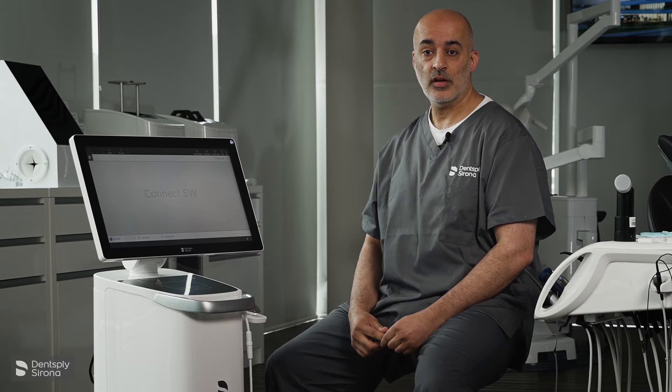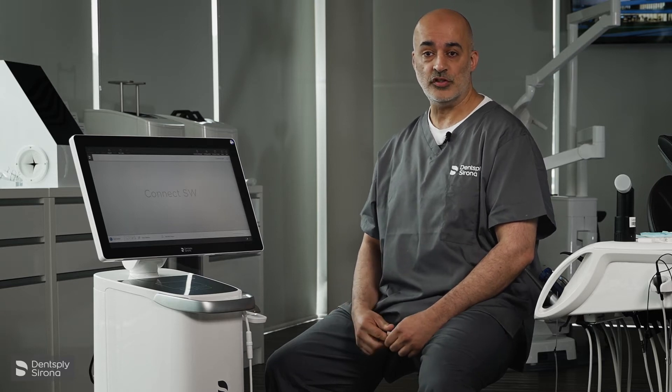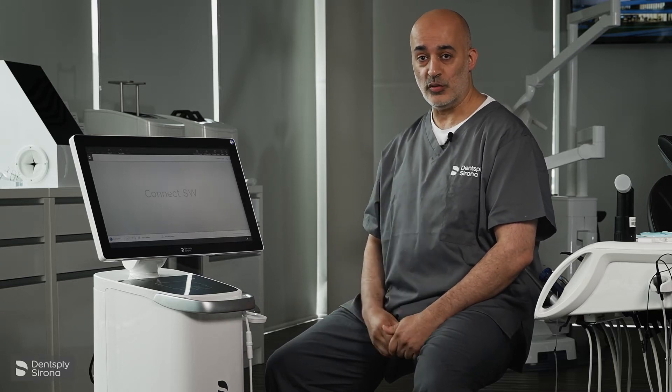Camera calibration is essential. It needs to be done once a month to maintain trueness and precision. So let's go through how we're going to do this.